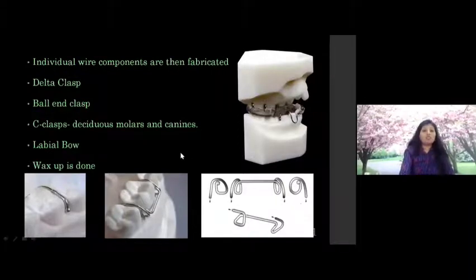Okay. After you constructed your wire bendings, you can do the wax up if you're planning to construct your appliance using the heat cure technique.